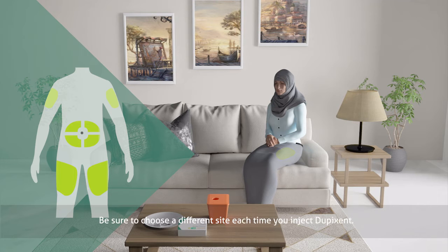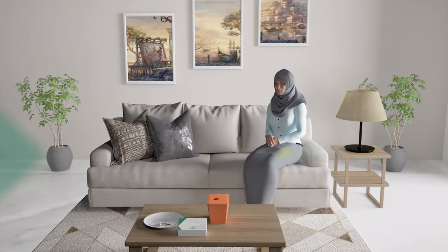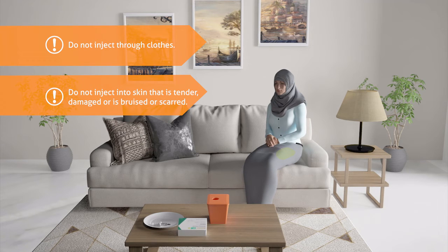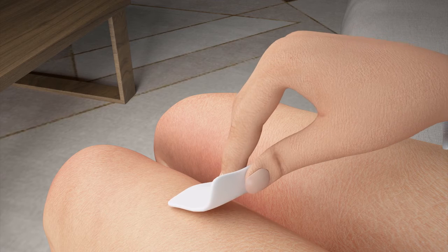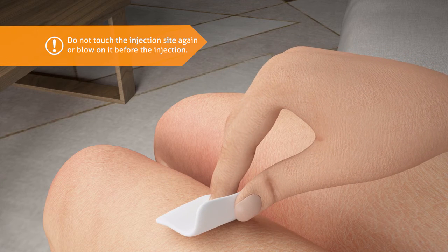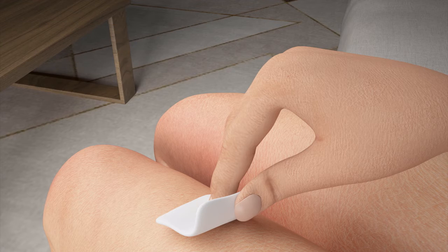Be sure to choose a different site each time you inject Dupixent. Do not inject through clothes. Do not inject into skin that is tender, damaged, or bruised or scarred. Clean your skin with the alcohol wipe. Do not touch the injection site again or blow on it before the injection. Let your skin dry before injection.